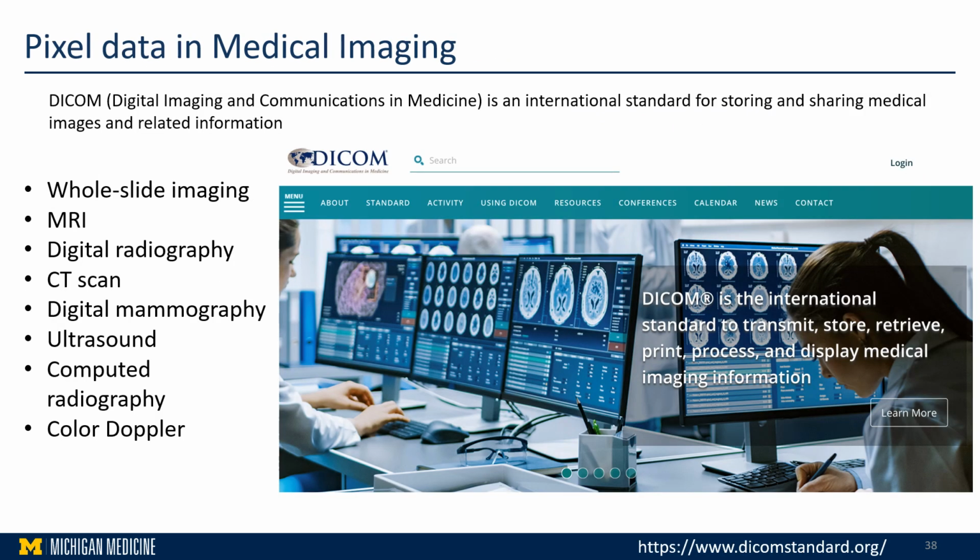That brings me to DICOM, which is Digital Imaging and Communications in Medicine. It is an international standard to transmit, store, retrieve, print, process, and display medical image information. And this standard has been used for ages, more than 20 years, by our radiology colleagues, and it is the standard format for all medical images. And fortunately, right now in pathology, we are starting to use this standard format.